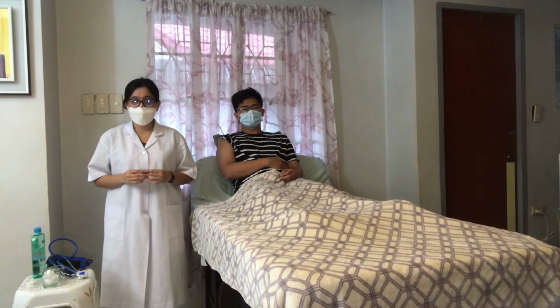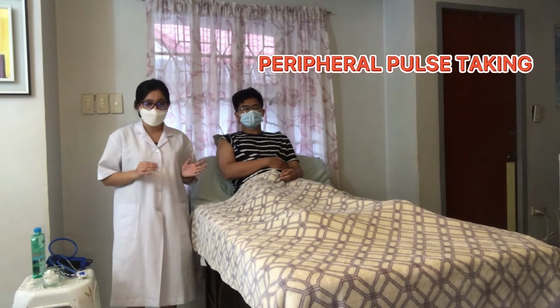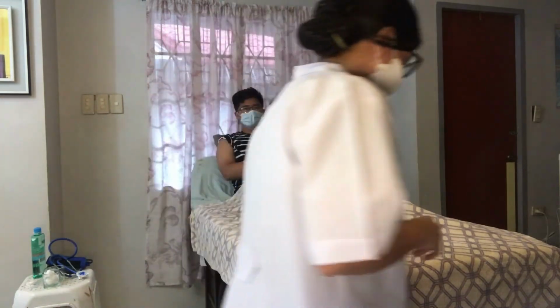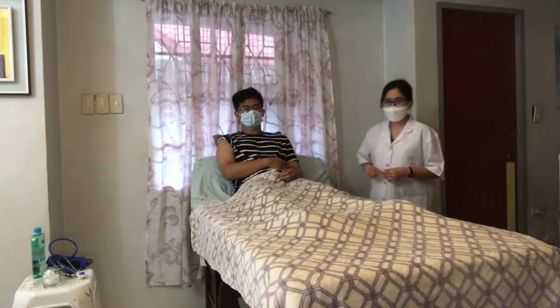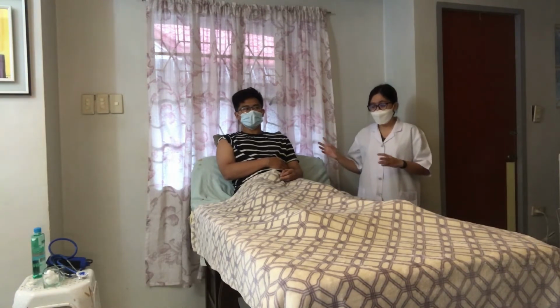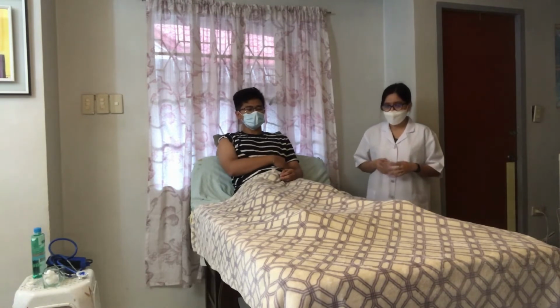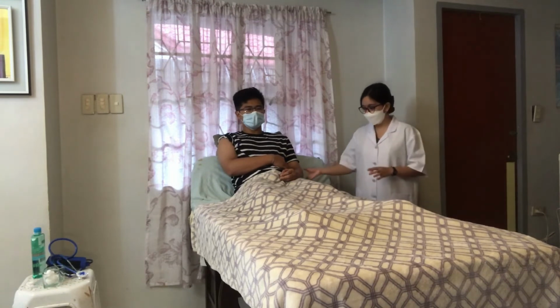Since the thermometer usually takes about 3 minutes before it buzzes, we are going to take the peripheral pulse of the patient on the other side. Since the patient is already in a comfortable position, we are going to select the pulse point. Normally, what we take is the radial pulse.